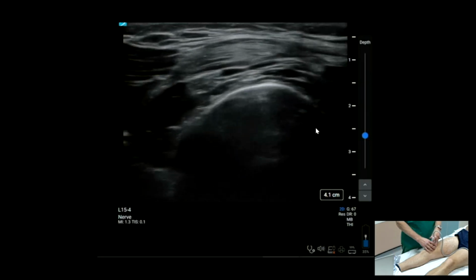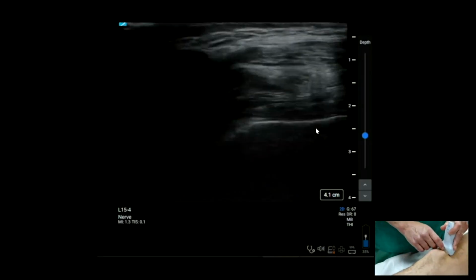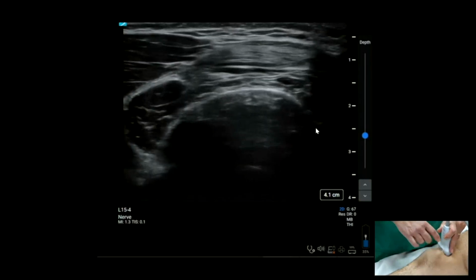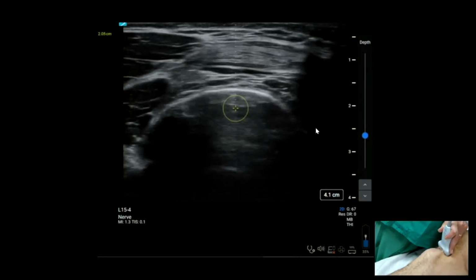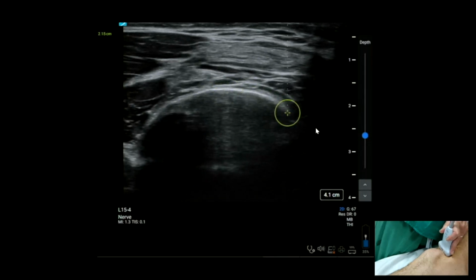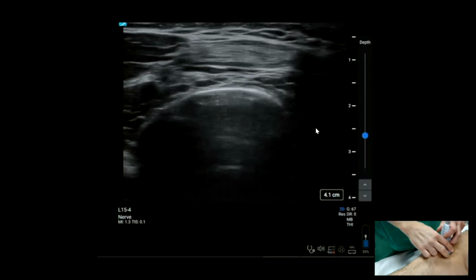And lastly, the nerve to vastus intermedius. This runs down underneath the vastus intermedius muscle on the surface of the femur. So I've come just above the patella, okay, and I've got the femur in the center of the screen, and I would be aiming to bring my needle straight down onto the femur, okay, and we inject and get spread of local anaesthetic going either side, just lifting that muscle layer off, and again 3 to 4 mils is sufficient to block the nerve to vastus intermedius there.